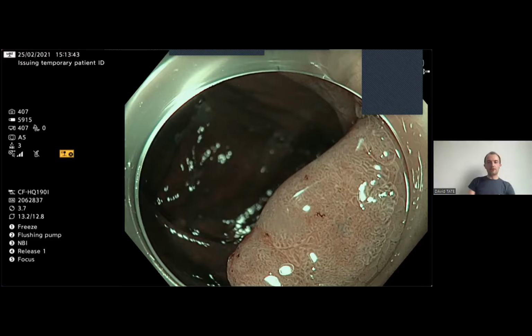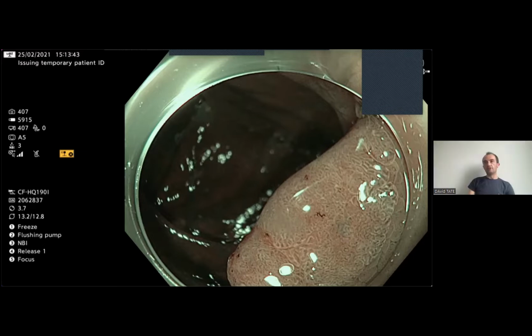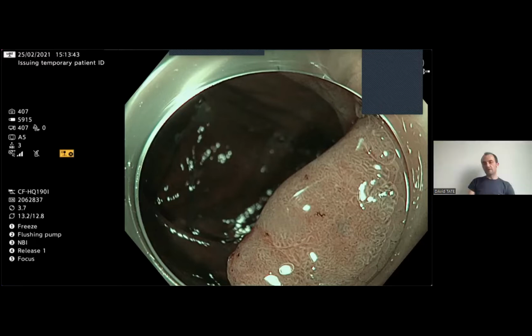Okay, and so I'm still not understanding your question. Maybe you can tell me it again. If you are saying to me that the edges are demarcated, I agree with that. Is that what you were saying, or was it something else? Oh yeah, you answered, because I said that I thought that it was described as having edges that are not well demarcated. Okay. And to me, indeed, the edges are demarcated. But does that make a big difference here? I don't think that makes too much difference to the analysis of this polyp.